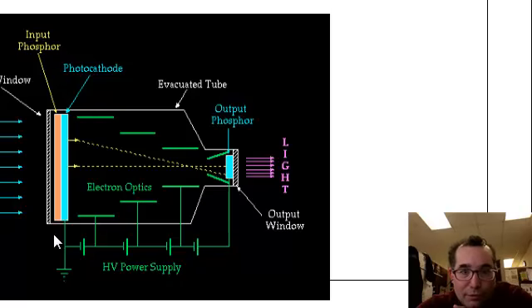Then our process, and we'll talk about this process a couple more times as we go through this. Our light will then interact almost immediately, right? Because they're sandwiched together with what's known as the photocathode. Photocathode is going to take our light, similar to what happens in the digital environment that we discussed again last week. It's going to take that light and turn it into electrons.